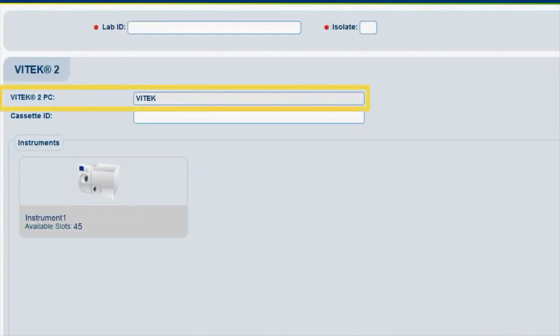The Vitek 2 PC field displays the PC to which the FlexPrep cassette will be sent. When connected to multiple PCs, more than one PC option is available for this selection.